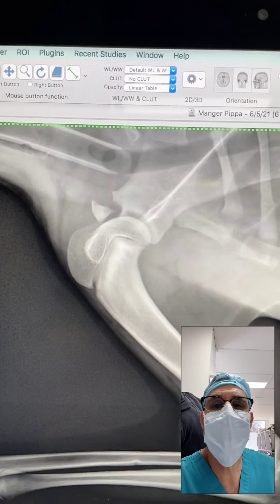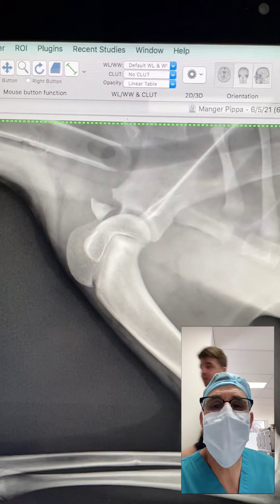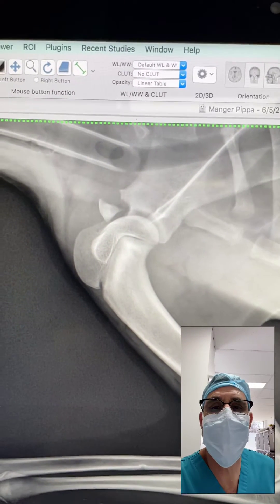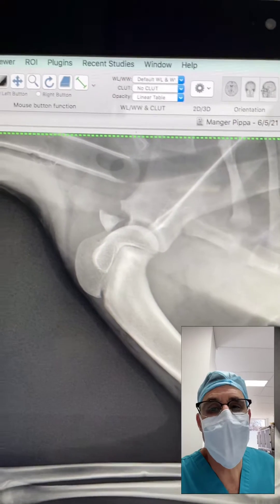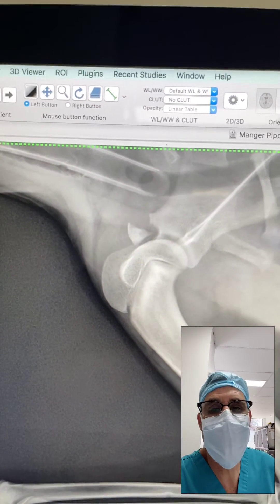It's a young dog, probably around six months of age, and we can see that it's got a bulging of this bone fragment where the biceps tendon originates on the scapula.